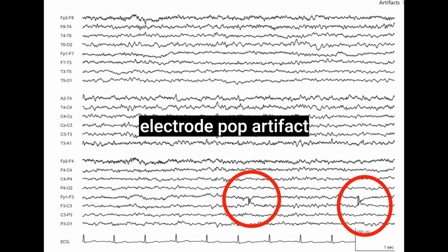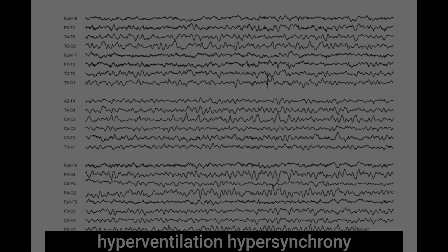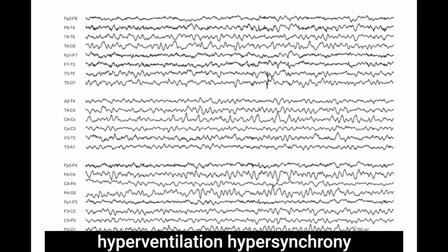Right, so we've talked about salt bridges. We've talked about all these different patterns. We're getting there. Is there anything else? Well, there's one more abnormal pattern I'd like to discuss. Okay, bring it on. This one is called hypersynchronous slowing. It refers to these highly regular slow waves that can be triggered by hyperventilation. Wait, hyperventilation like when you breathe really fast? Exactly, like when you're breathing really fast and deep.